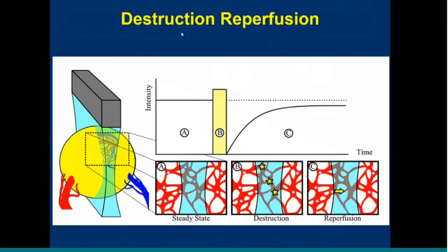For this, we've been using a dissecting microscope in a room that's adjacent to the ultrasound scanner. We inject our 50 microliters of microbubbles into the animal, and it is allowed to perfuse through the vasculature back and forth. The lifetime of the bubbles is going to be about 20 to 30 minutes in the CAM, I would say. Wouldn't go much longer than half an hour, but that's a good time point. So there's plenty of time to allow it to perfuse, move the animal over, and couple it to the transducer. And because the bubbles have been flowing through and doing a full circulation of the vasculature, all the organs are fully perfused with bubbles at this point.